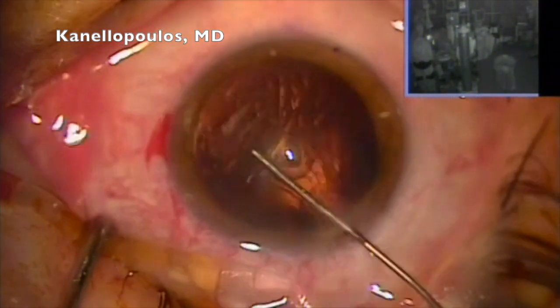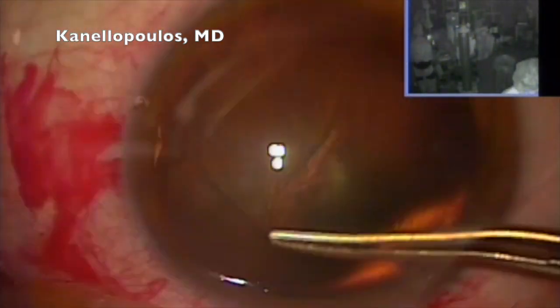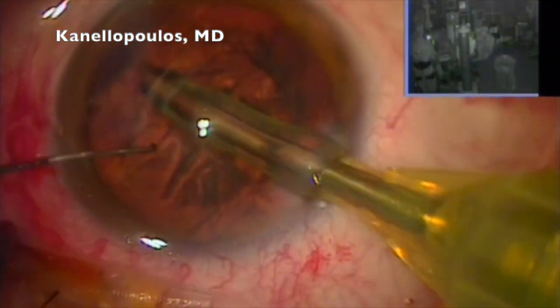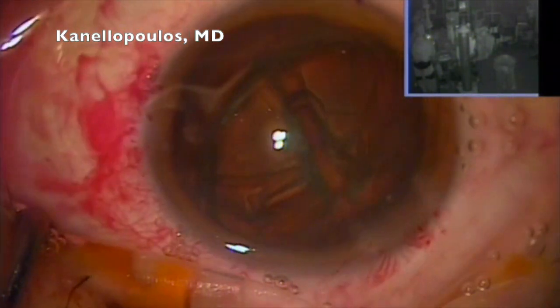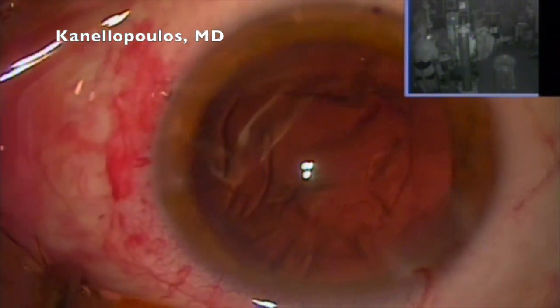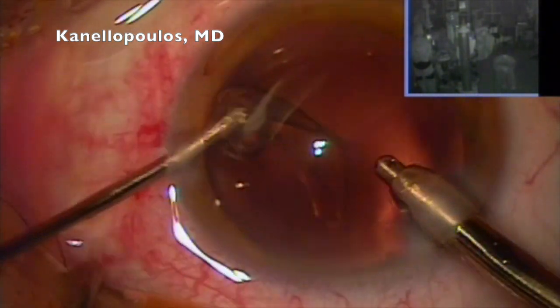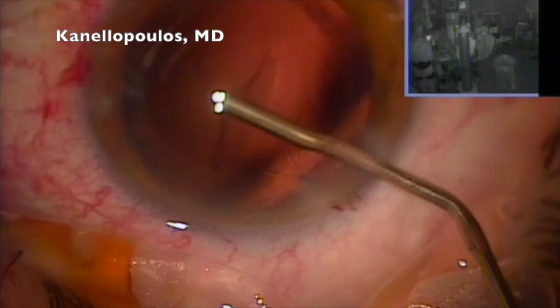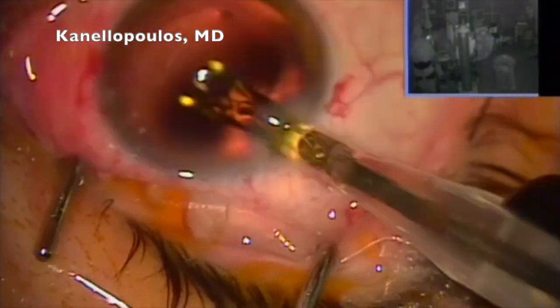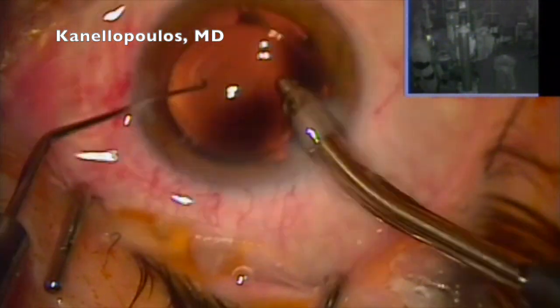Second eye — right eye of that same patient, a little easier for me; I'm right-handed so I'm not operating over the nose of this very nice lady. Obviously this may start to look boring, as we're seeing basically the same procedure, but these are unedited case series from day to day. I expressed again the nucleus in the anterior chamber, removing the cortex — very careful to come in with my left hand and remove the cortex under my main incision. The bag is filled with methylcellulose. Document the lens, roll the lens in the D-cartridge. Our magnificent Akersoft Aspheric toric lens — under the lens, removing the viscoelastic over the lens.